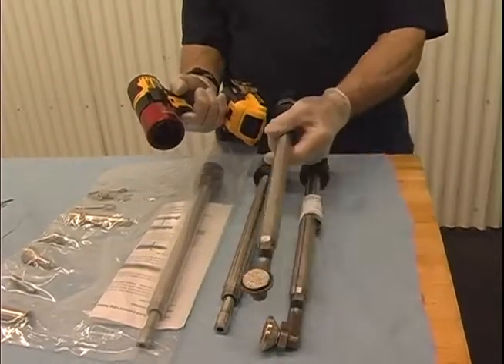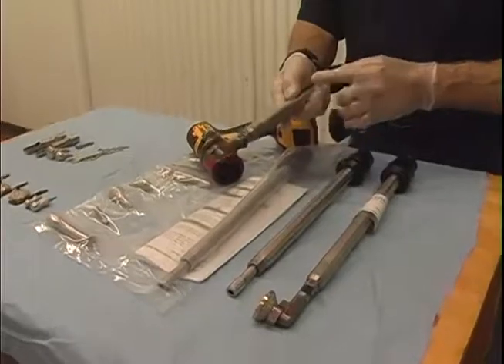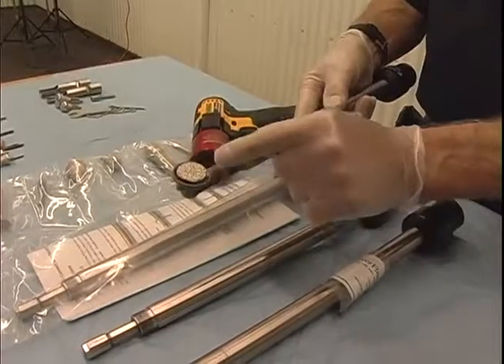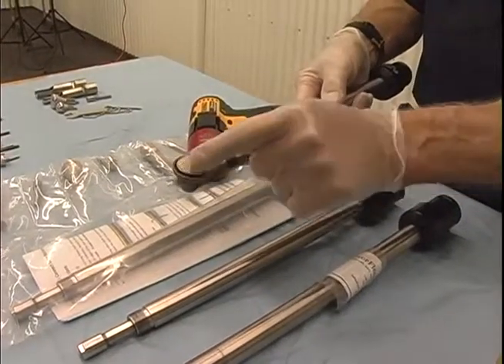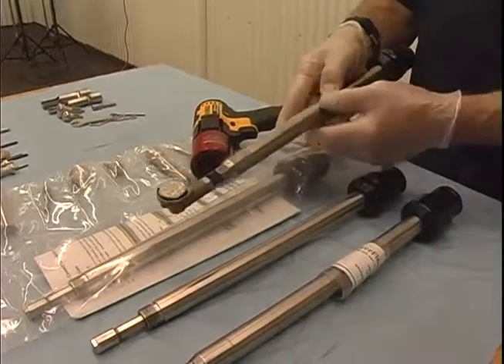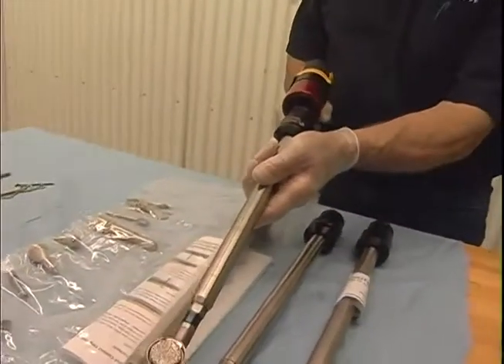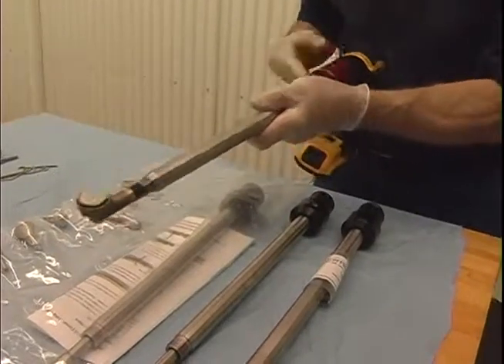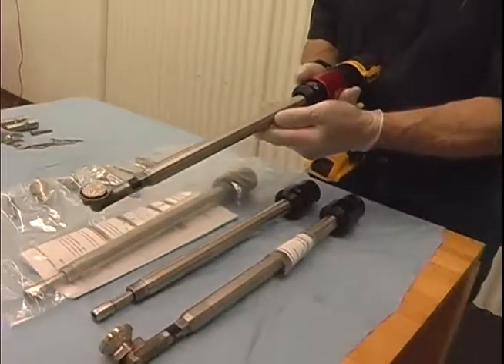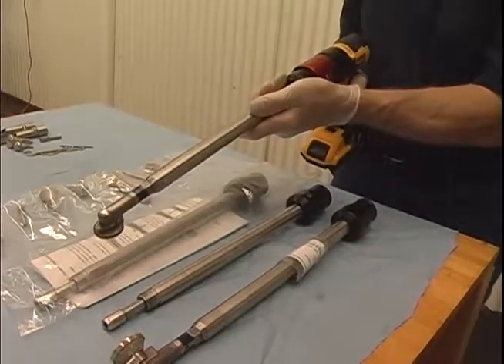This is called the guarded right angle. It is a solid shaft with a right angle gear system and a guard which protects the tongue and cheek from this grinding wheel, which has a diamond surface on it to grind away at the teeth. And this particular shaft, like all of them, will click onto the PowerFloat. This is the up position to do the upper teeth, and it clicks on into down position for the lowers.